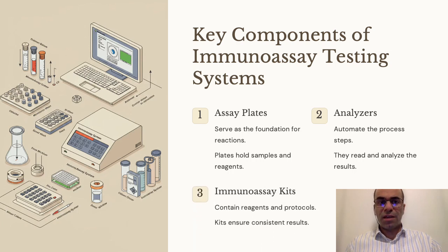And number three is immunoassay kits, which contain calibrated antibodies, detection reagents, buffers, and reference standards, and include validated protocols for specific analytes with defined sensitivity and detection ranges.